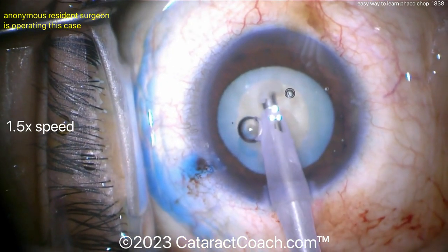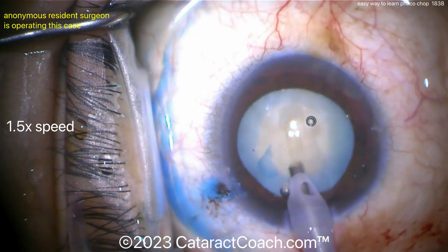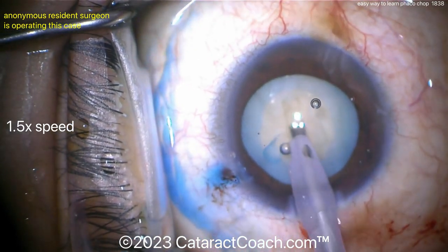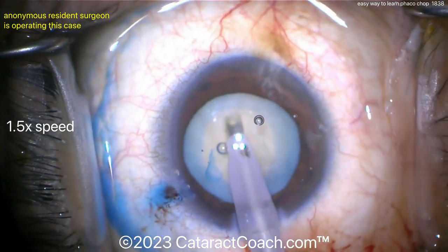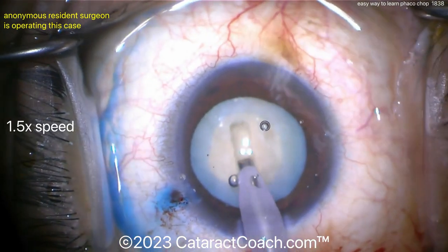So let's see a groove down the middle. What the surgeon is going to do here is basically a divide and conquer, and then each piece you bring up you can chop. That gives you an easy way to learn how to manipulate the chopper and how to use the two instruments together. Here you can see a groove down the middle with this white cataract.